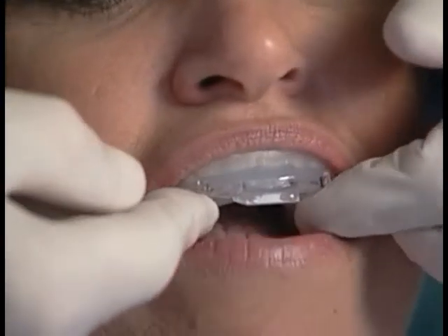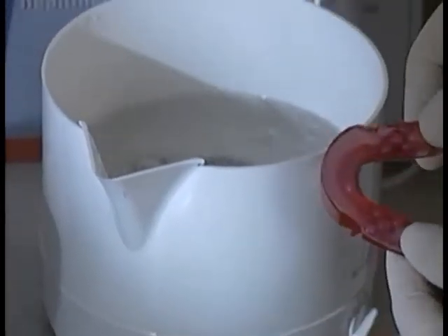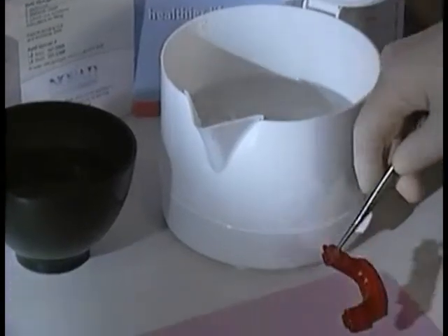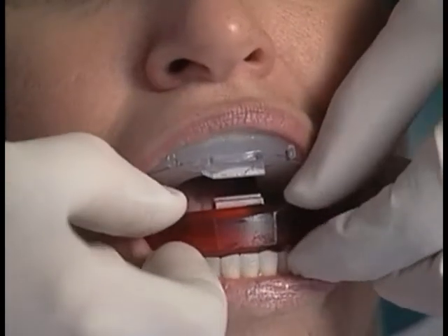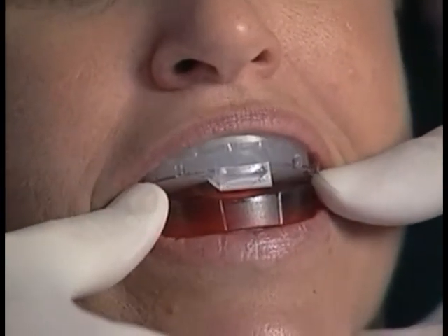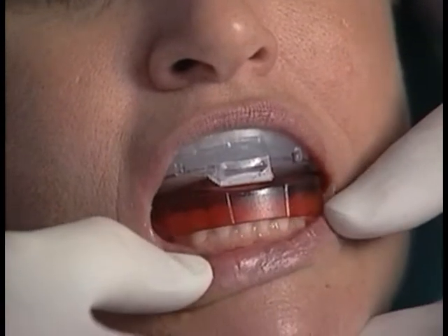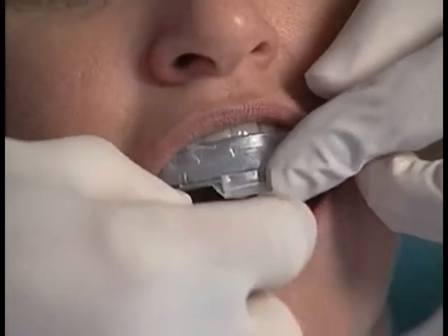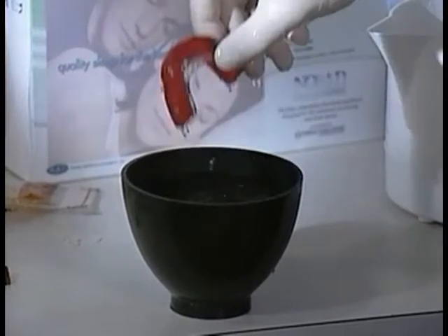Now you're ready to fit the lower device using the same procedure. Place the lower colored device in boiling water for 3 minutes, then remove and cool for 30 seconds. With the upper NORAD in place, insert the lower device in the patient's mouth. Initially seat the lower with light pressure, and then have the patient bite down firmly against the upper device. Allow both upper and lower to remain seated for 5 to 10 seconds. Remove the lower device, cool it further underwater, and immediately reseat it.